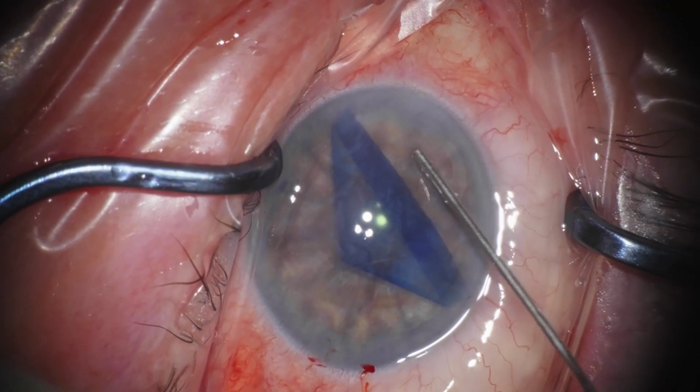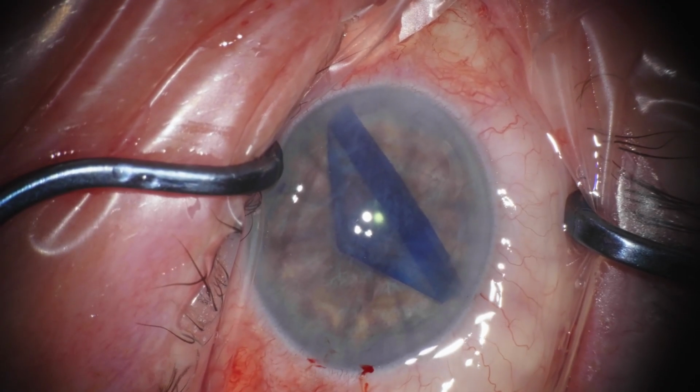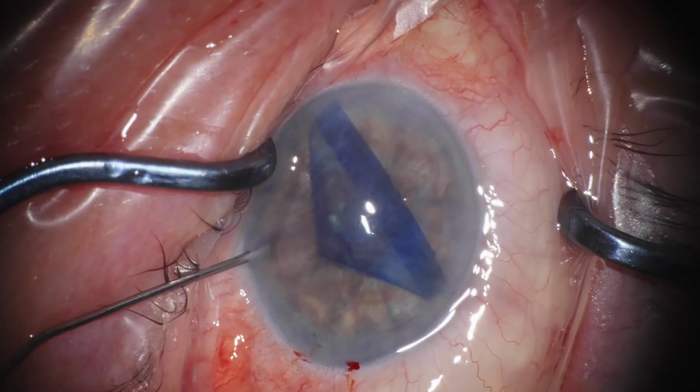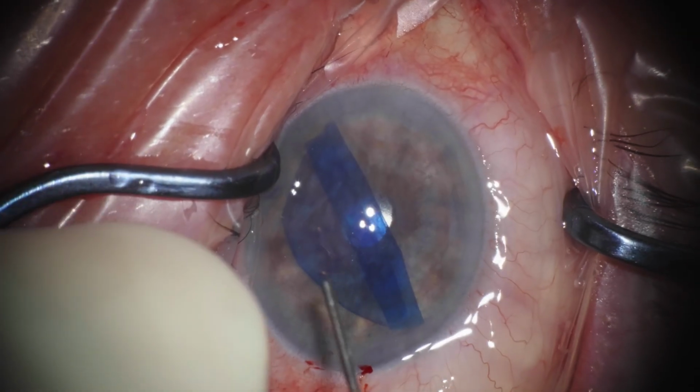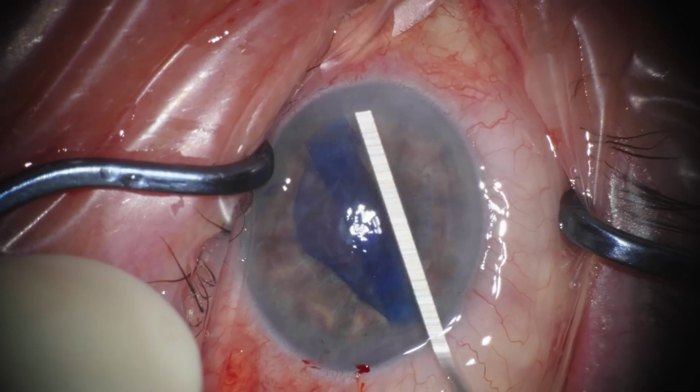And in this case, we had issues with flipping the graft. We tried to do it multiple times. This video is heavily edited. And finally, we've managed to do it. So we can see the proper S-mark configuration.